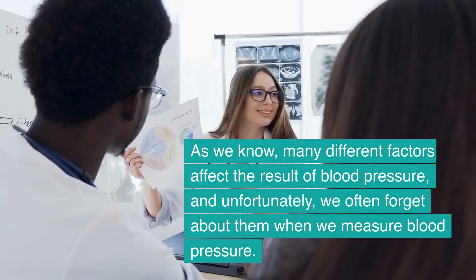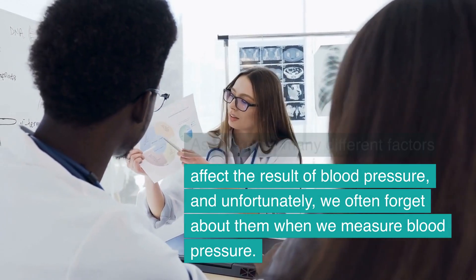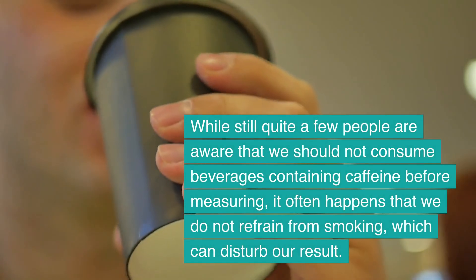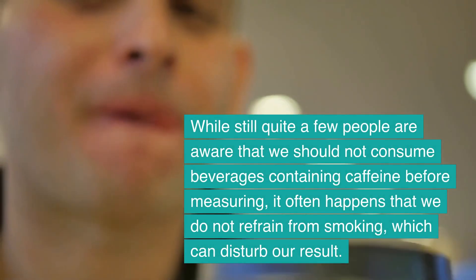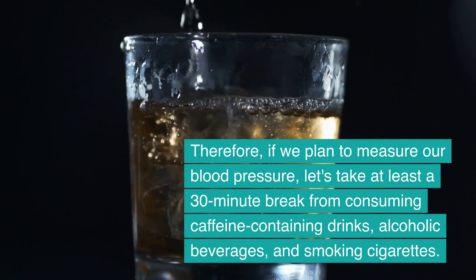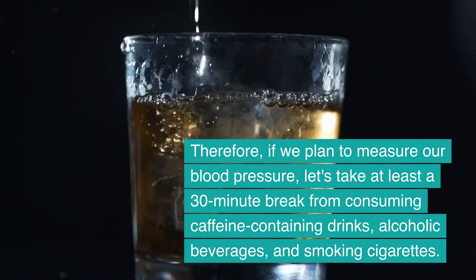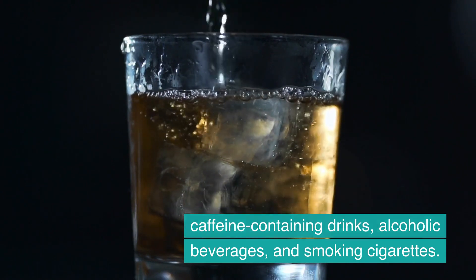Many different factors affect the result of blood pressure, and unfortunately we often forget about them. While quite a few people are aware that we should not consume beverages containing caffeine before measuring, it often happens that we do not refrain from smoking, which can disturb our result. If we plan to measure our blood pressure, let's take at least a 30-minute break from consuming caffeine-containing drinks, alcoholic beverages, and smoking cigarettes.